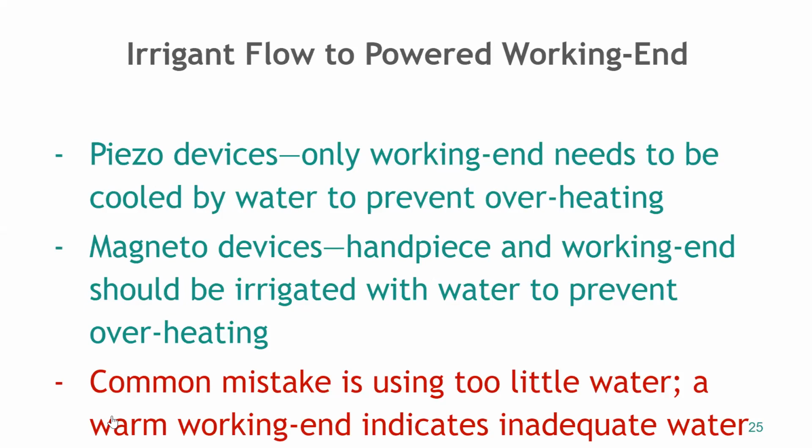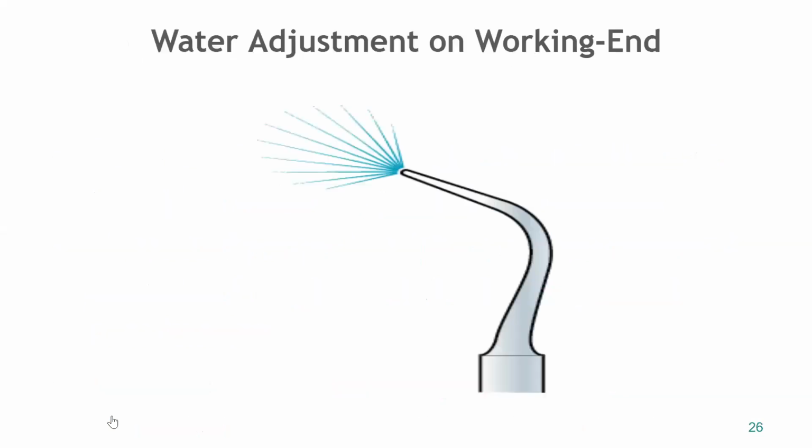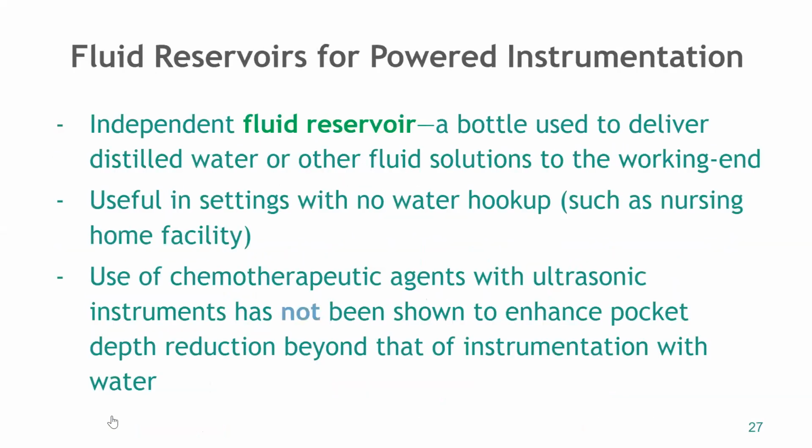So with the piezos, we're only going to change the very end tip, and the magneto devices are Cavitrons. We have both the magnetic stacks and the tip that we change between patients, and it's all connected together as one big piece. Okay, so water adjustment on the working end.